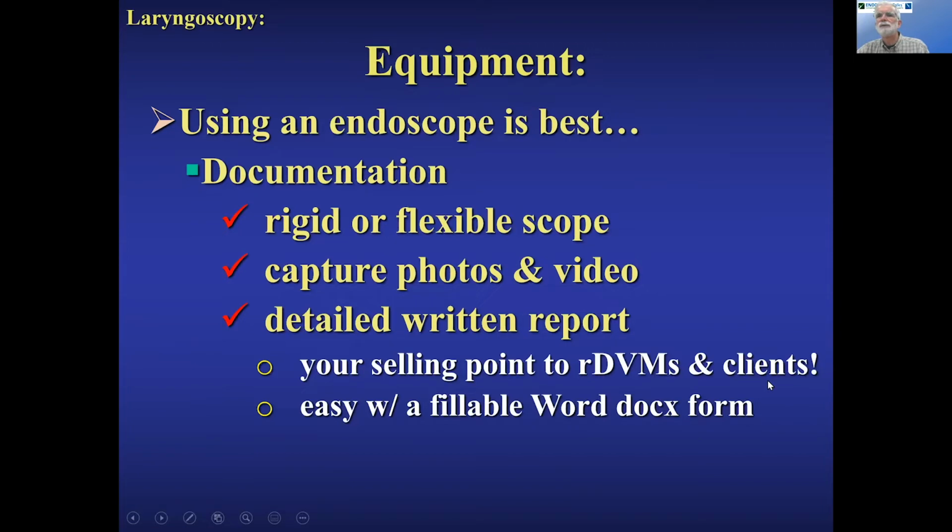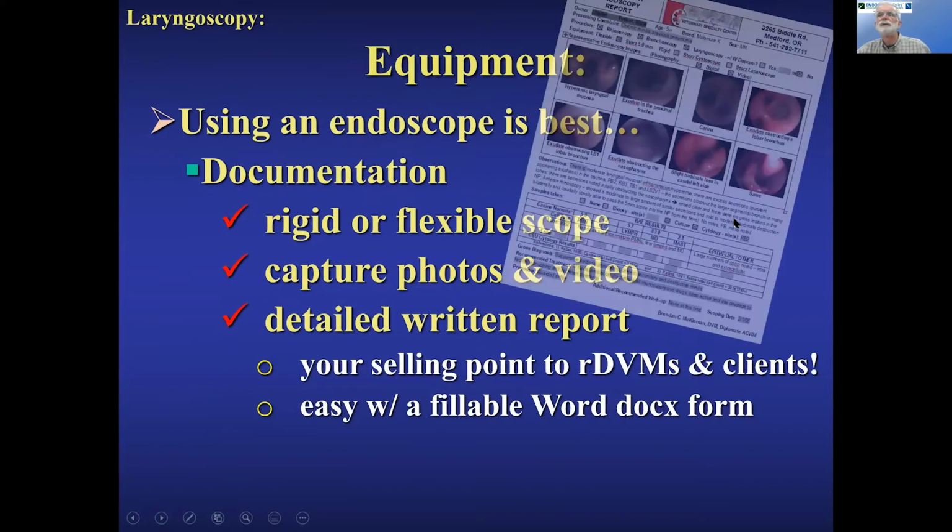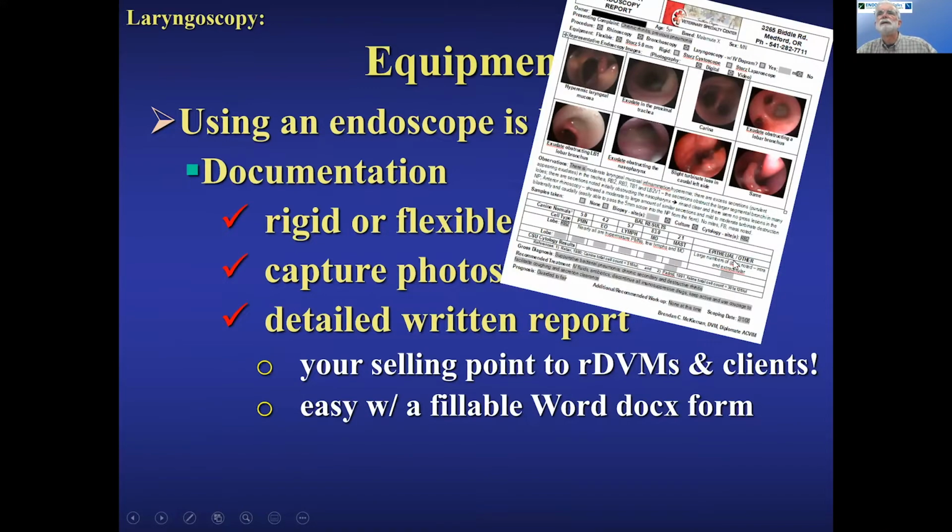When my clients walked out the door, they had a fillable form that I was able to give them. This is just one example. This was a bronchoscopy. Just the different images, a couple of abnormalities, the cytology that I saw. By the end of the day, I would have that read myself and put in there, and they went home with something that they spent thousands of dollars for in their hands, and then putting the CD together for the images and the referring veterinarian. So I encourage you to consider that. Just a fillable Word document, talk to your grandkids or somebody that can do that for you, because I can't.